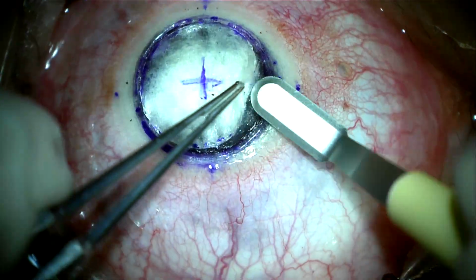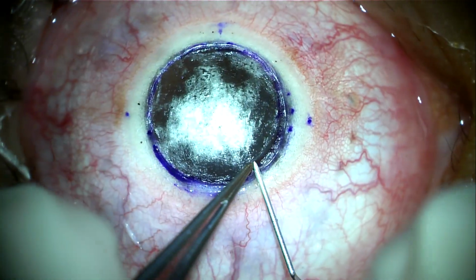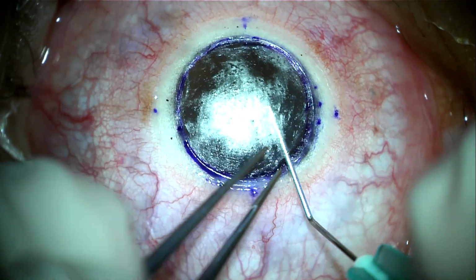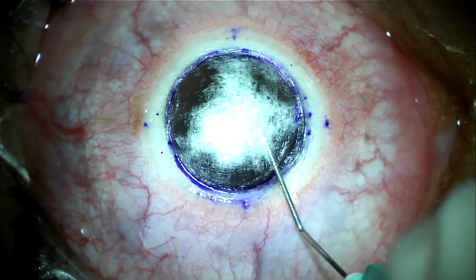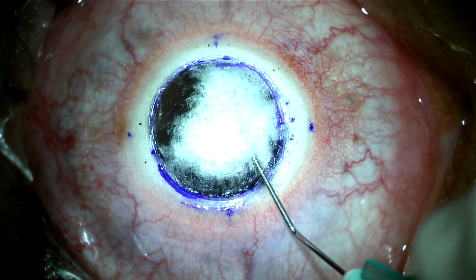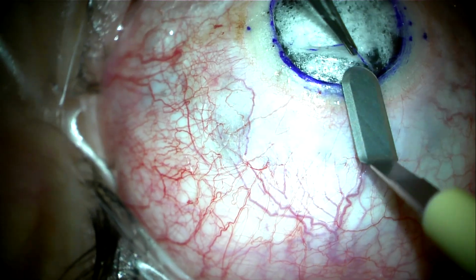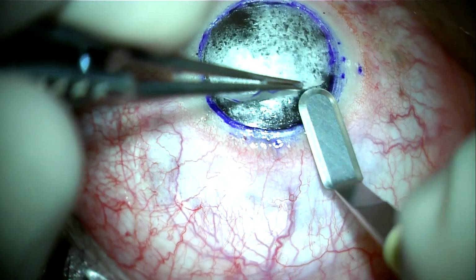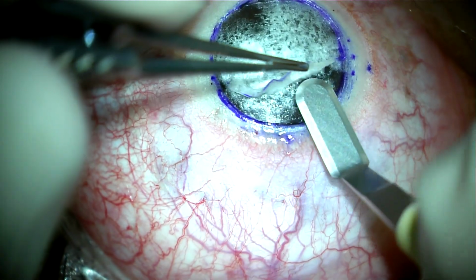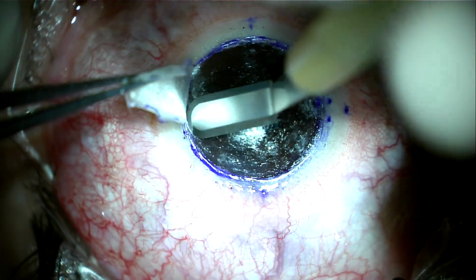So now I am marking the trephination groove to ensure proper cutting of the stroma during scissoring. This is followed by superficial keratectomy and re-injection of air at a deeper plane in another trial to get a big bubble. Now I am dissecting another layer of the stroma, realizing that I will not have a big bubble and will continue the case by manual dissection.